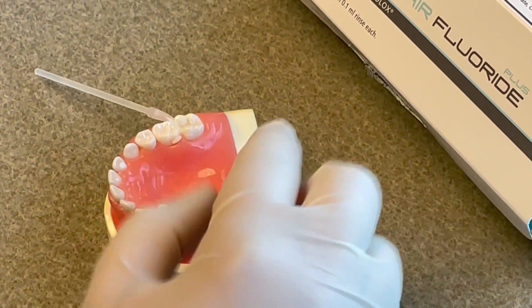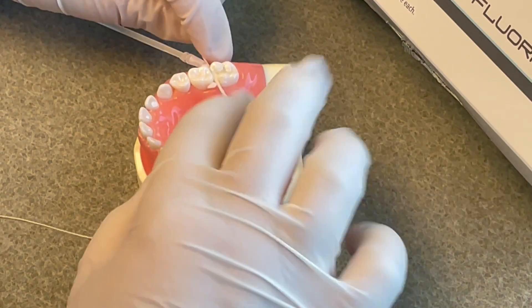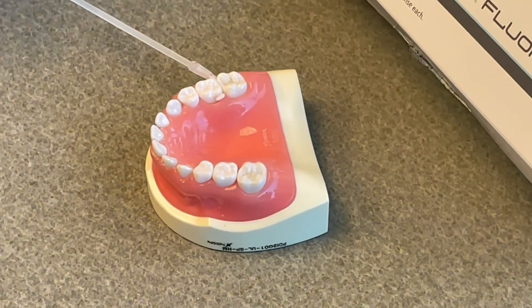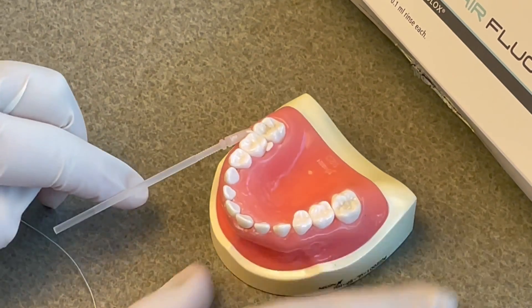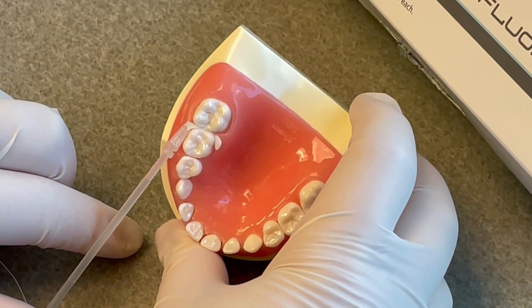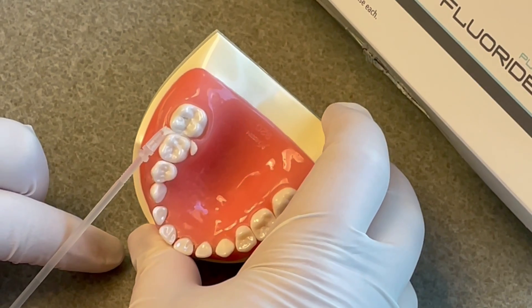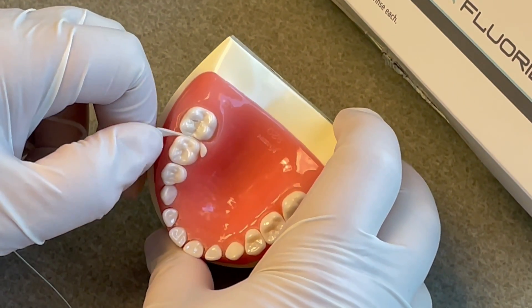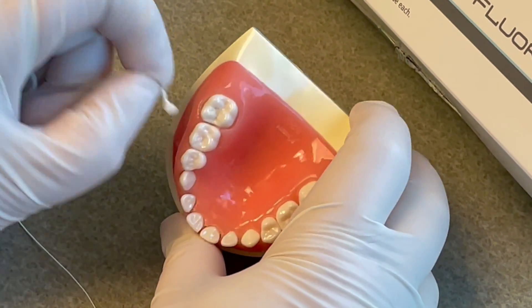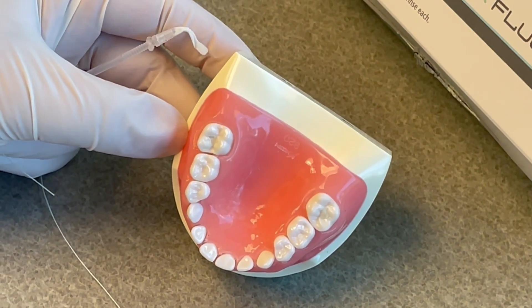That's working — the sponge has to touch the surface that you're treating. Perfect! Voilà! You'd have someone helping you in a clinical setting, but see how it's in there. You need to leave it in there for five minutes. After five minutes, you can remove it, cover the treated site with a fluoride varnish, and then check them again in three to six months.